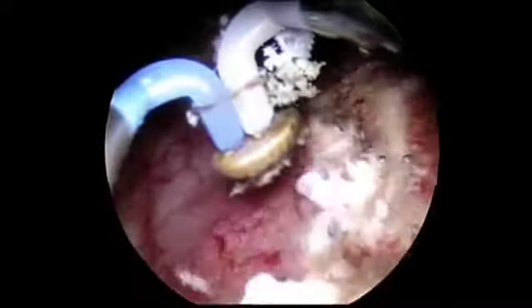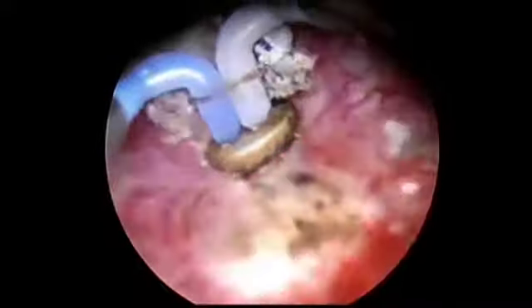As you can see, we have had a complete tumor resection of all tumors. Hemostasis is excellent. This patient's pathology was all low-grade TA disease. We were able to obtain accurate stage and grading information.